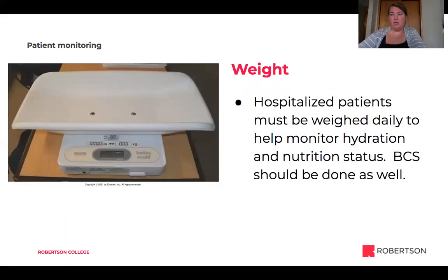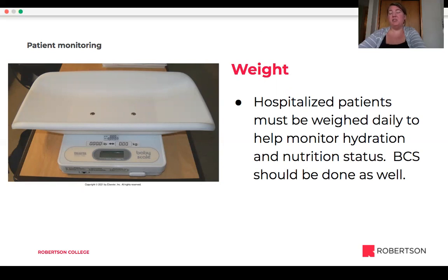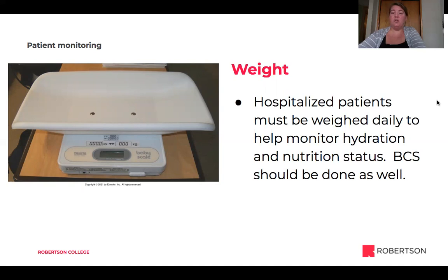So after we've monitored our four vital signs, so temperature, respiration, heart rate, and perfusion, we're going to go ahead and also monitor our hospitalized patients for their weights. So we do want to monitor hospitalized patients daily. And for patients that aren't hospitalized, we want to weigh them every time they're in.